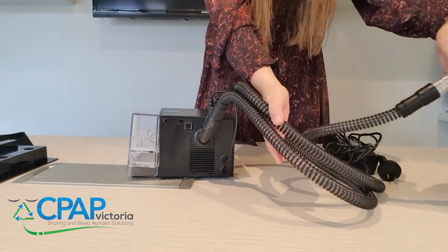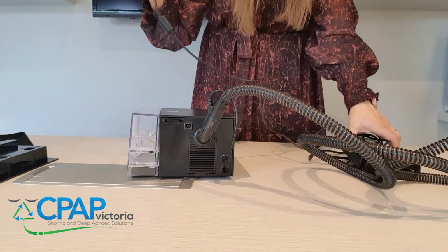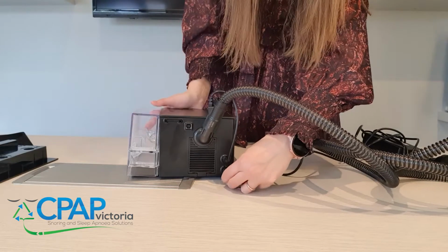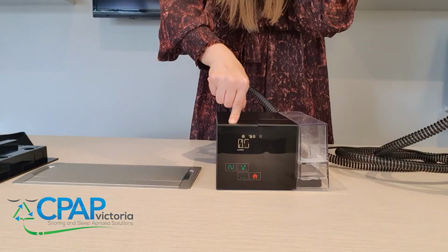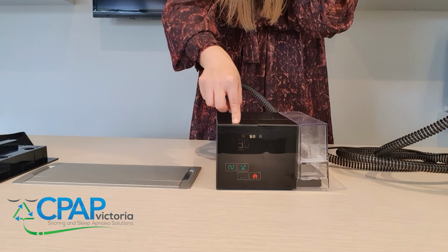The power supply unit goes into that bottom connection there and will only fit into the bottom connection. Plug your power in and the machine will power up. As you can see, we just press that top button just to turn it on and off.